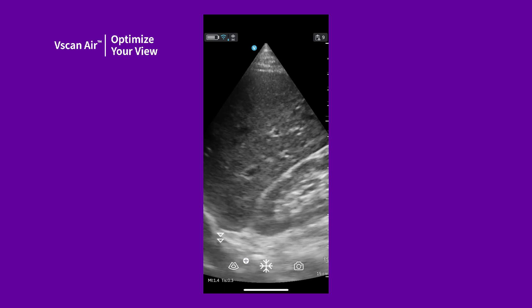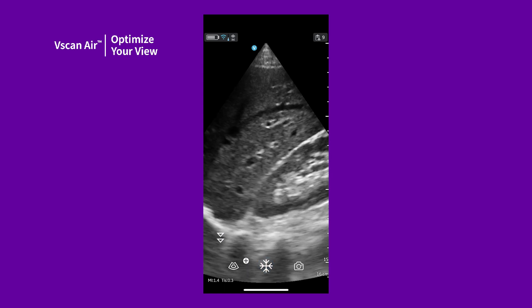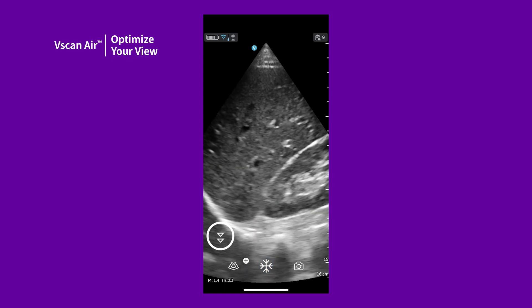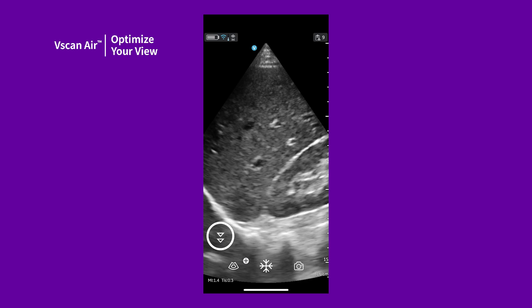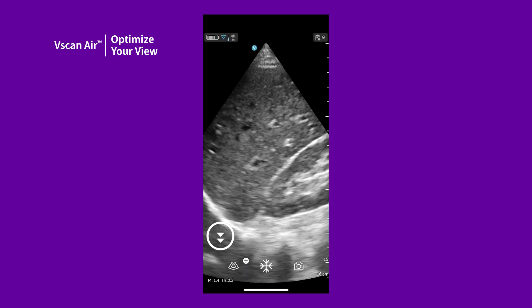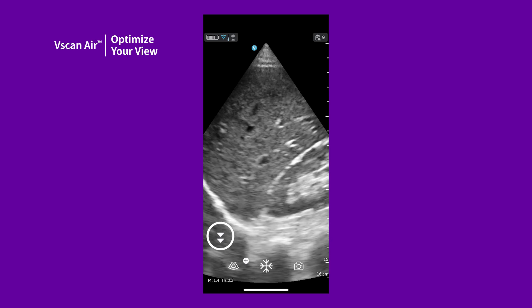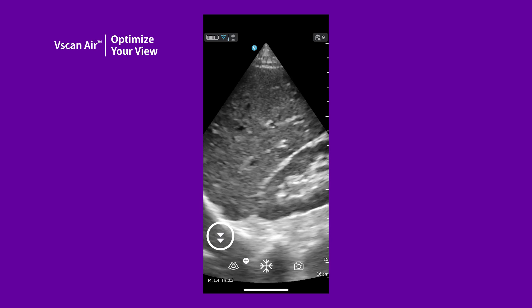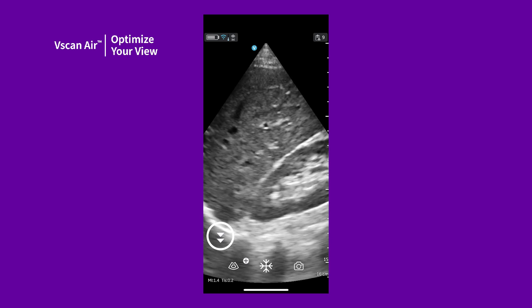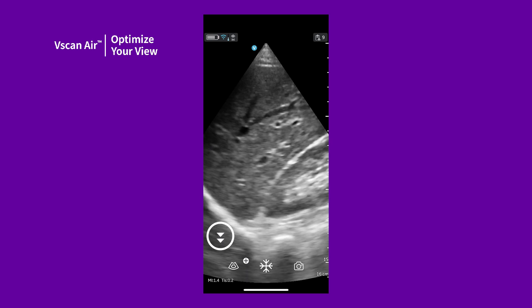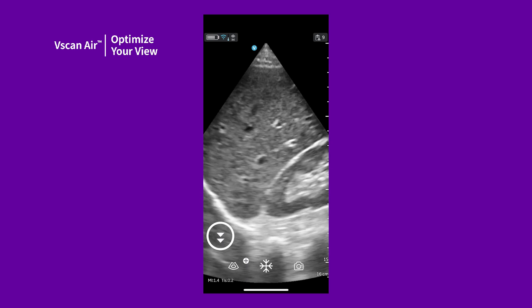On the abdomen preset, there is a penetration button on the black and white live imaging screen. Tap this icon to go to the penetration setting. When solid, it is on penetration. This is useful for imaging at greater depths in larger than average or difficult to scan patients.